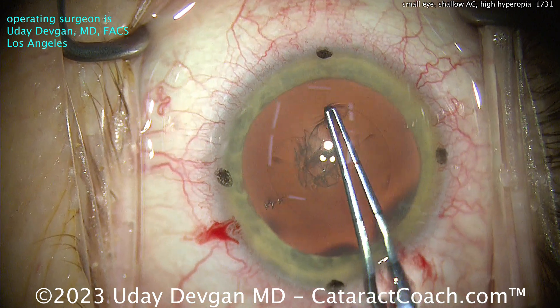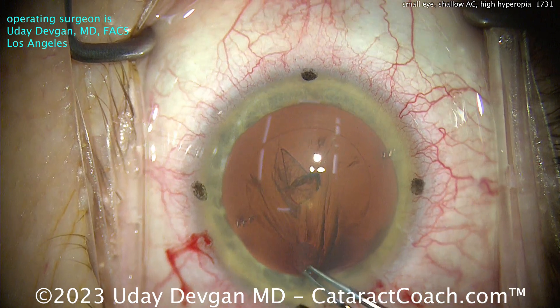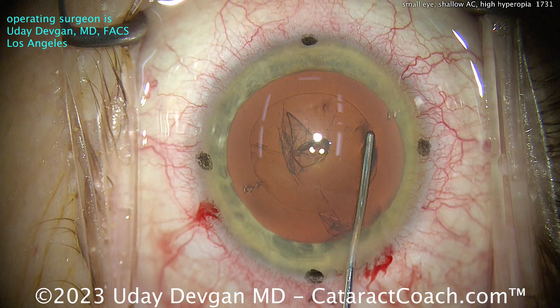We're getting our capsulorhexis done here. I'm being very meticulous and precise — I want that exact 5 to 5.5mm rhexis. Look at that: measured 5mm on the dot, beautifully round, nicely centered. It looks great.